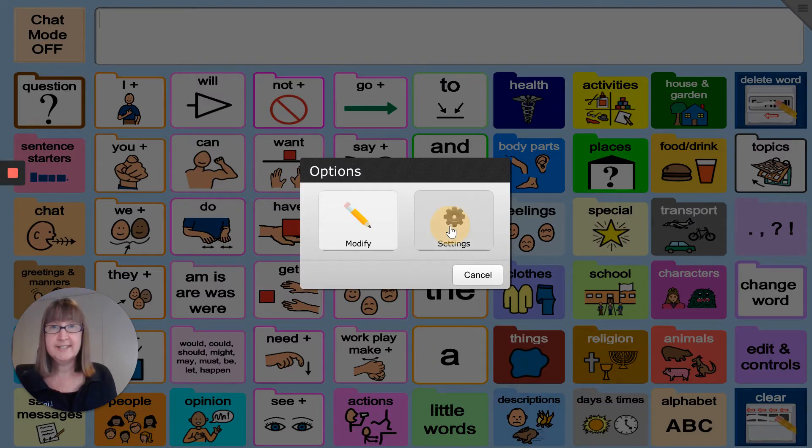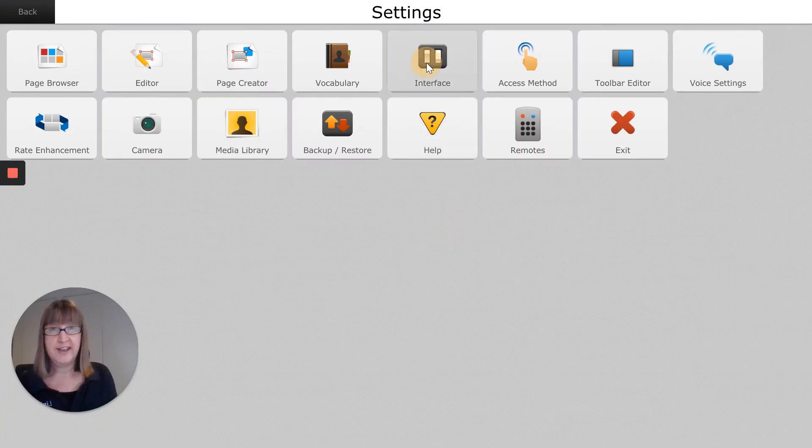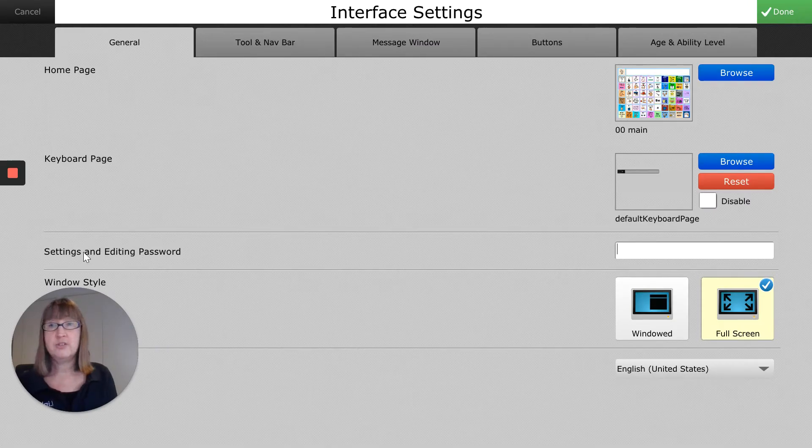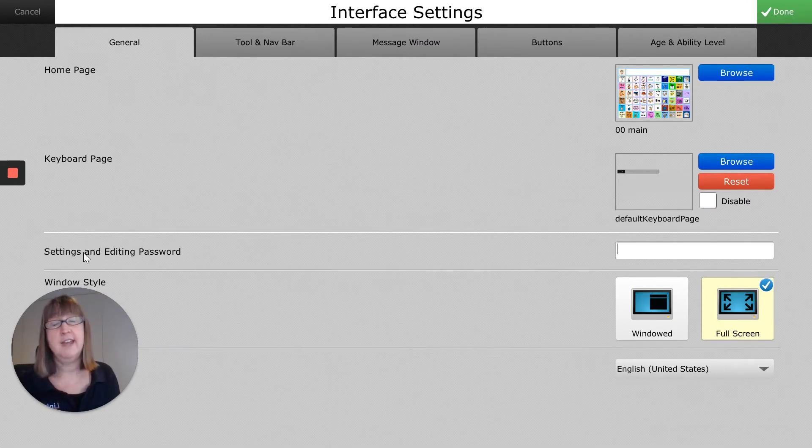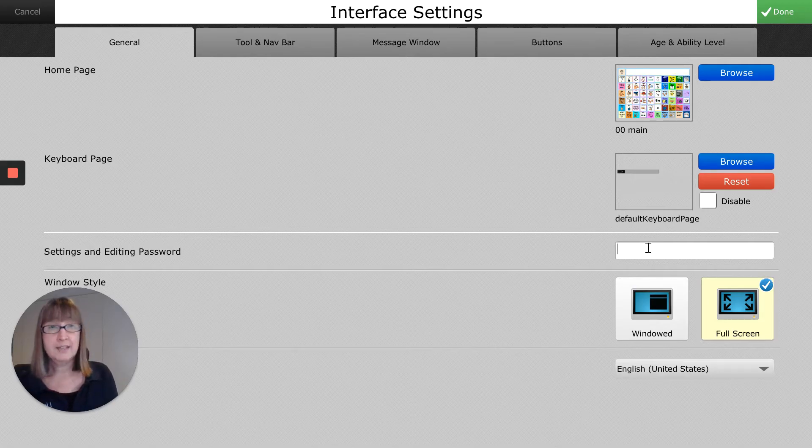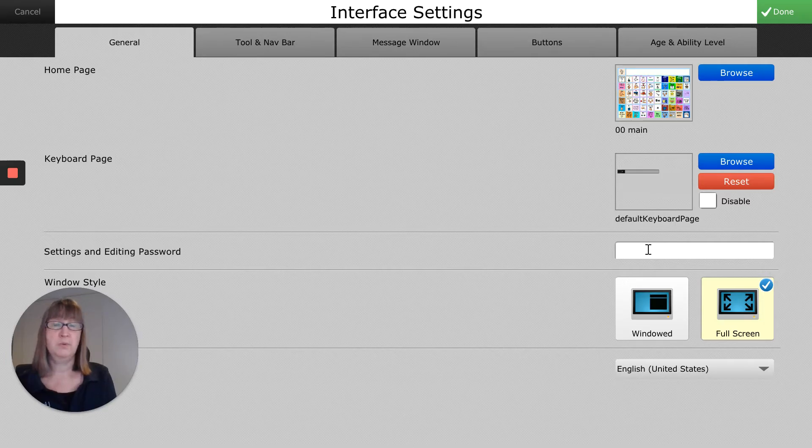choose settings and then go into the button called interface. Here you'll see a heading called settings and editing password. It's blank, but once you put something in there, that is what the password will be set as.